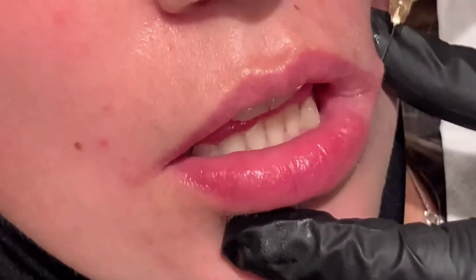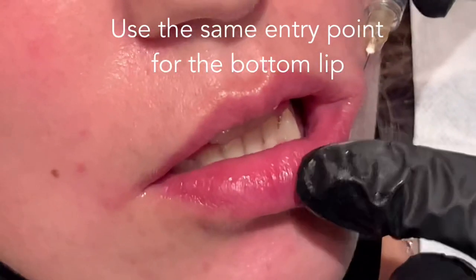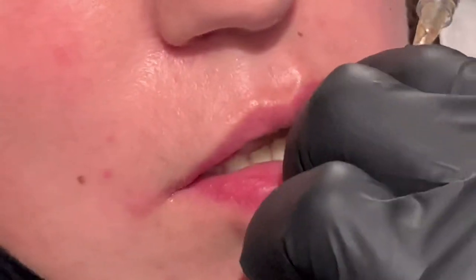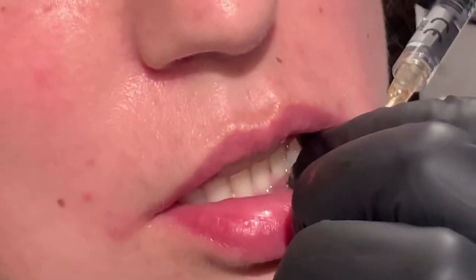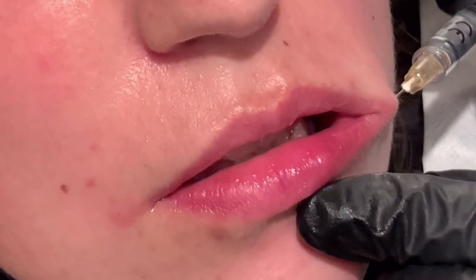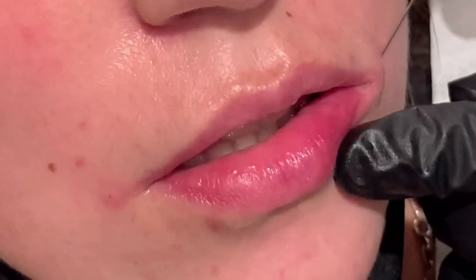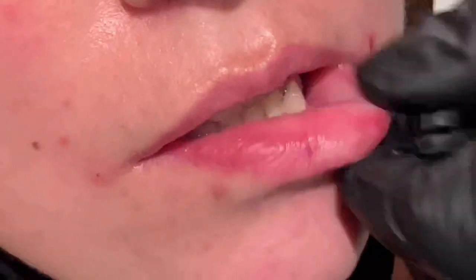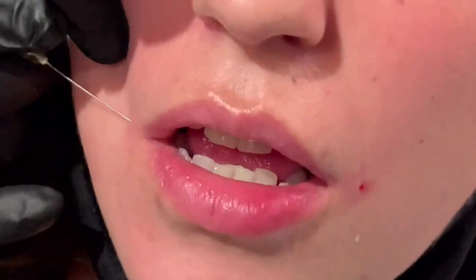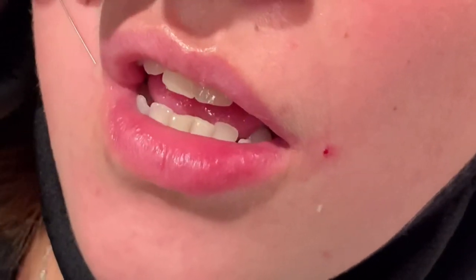The beauty of this technique is I still use the same entry point for the lower lip. I'm pinching both sides of the lip to guide the cannula through because I am hitting some septi there, and I'm aiming for the lower pillow, which is in line with the golden ratio. I tend to place product in a retrograde fashion. I massage everything out, make sure it looks great. Now we go to the last quadrant, again to the same entry point, and I guide my cannula to the last pillow.